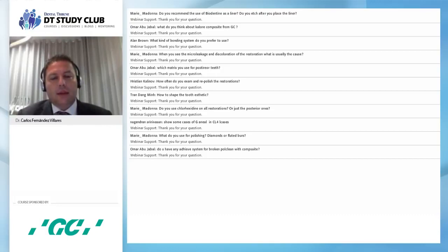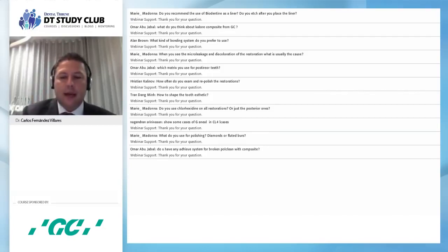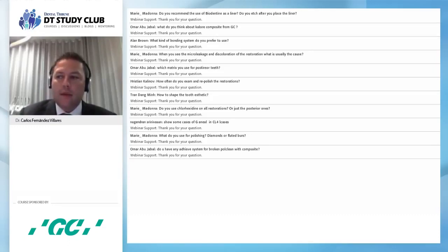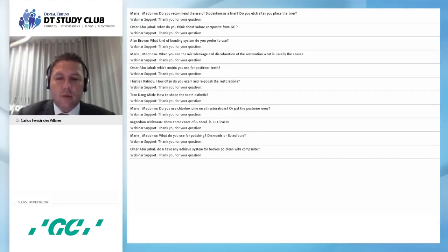Then with the recipes that we have for the composite resins, if for example we have an A2 color from a Vita shade guide, we put the dentin and the exact thickness of enamel. We put a 0.5 thickness, and then we can obtain more predictable results. So now with the photographs and with the color and devices like the lamps, we can obtain very good results.